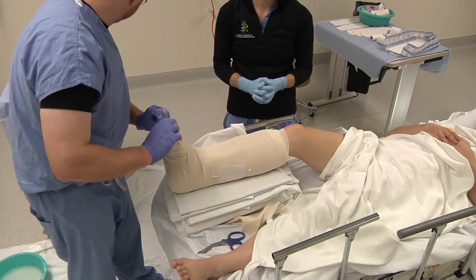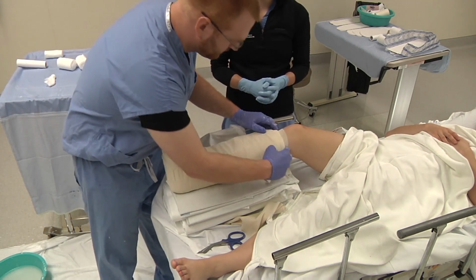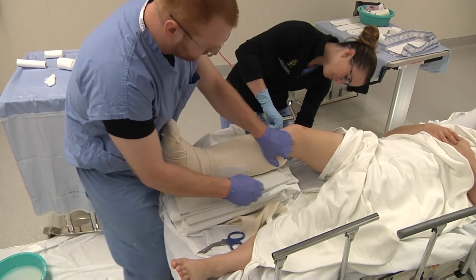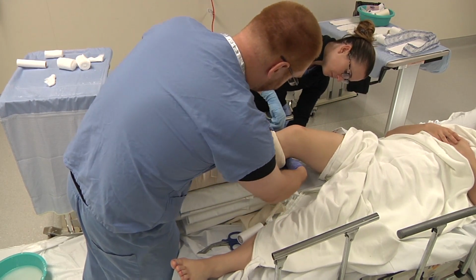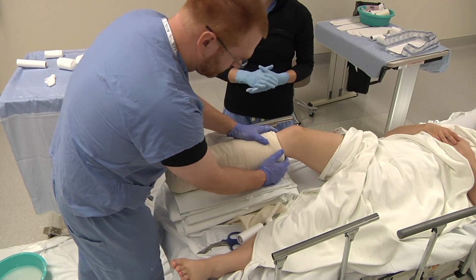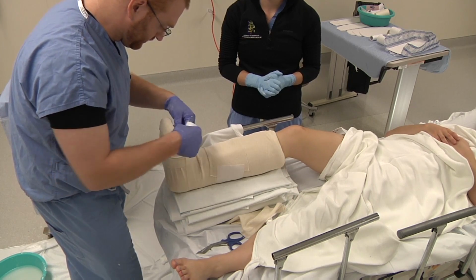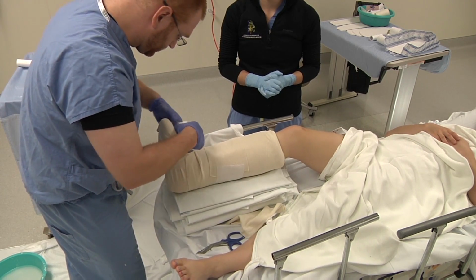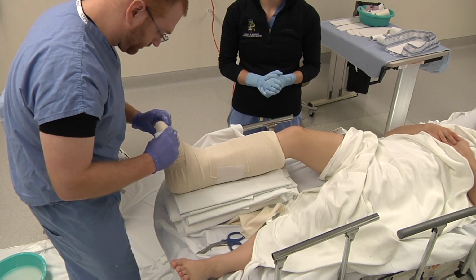After your splint material is hard, you can apply the appropriate tape. Make sure to check all areas at the top and bottom of your splint to make sure that there is no splint material that is sharp or pointy or contacting the skin, as that can cause burns, skin erosions, ulcerations. You want to be able to see the toes, all of them, so that you can perform a neurovascular exam.